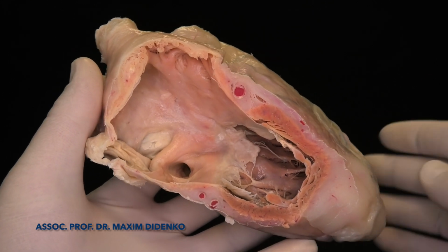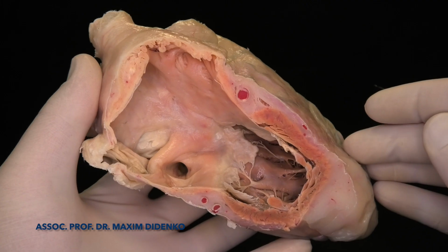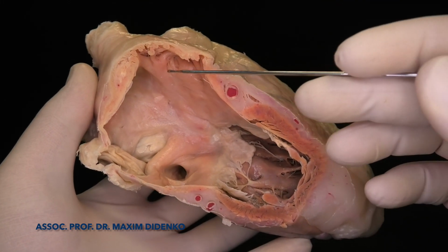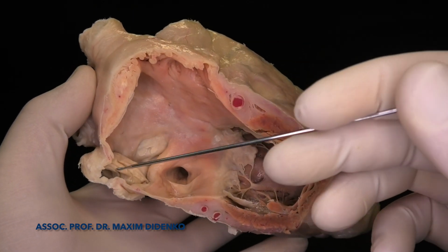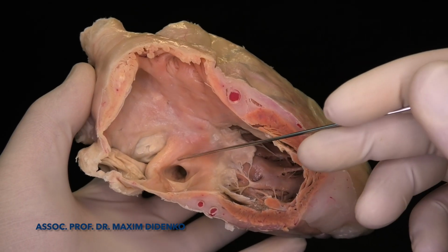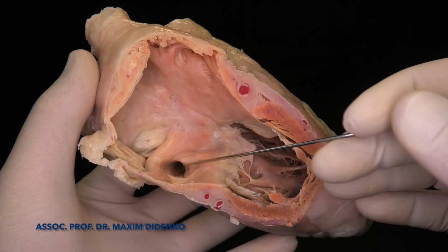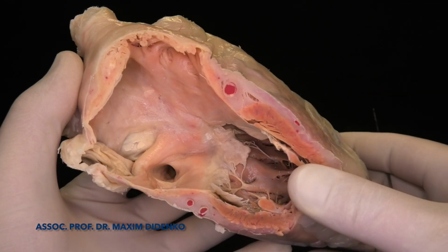Now we going deeper into AV node and his anatomy. Again, we are in the RAO projection. This is superior vena cava, inferior vena cava, fossa ovalis, coronary sinus with the Thebesian valve here, and tricuspid valve with septal leaflet.